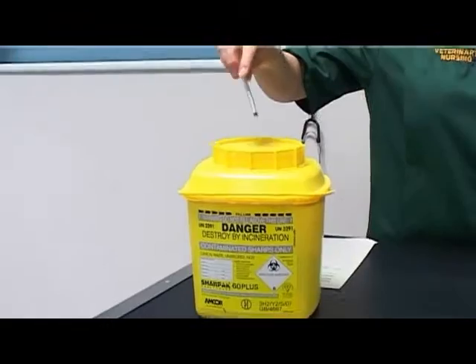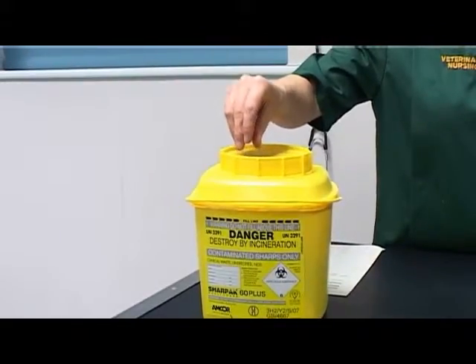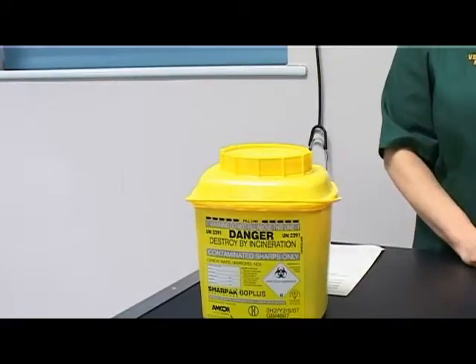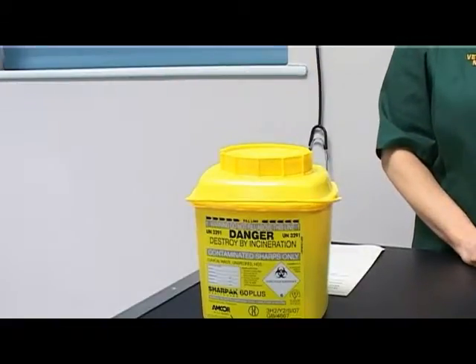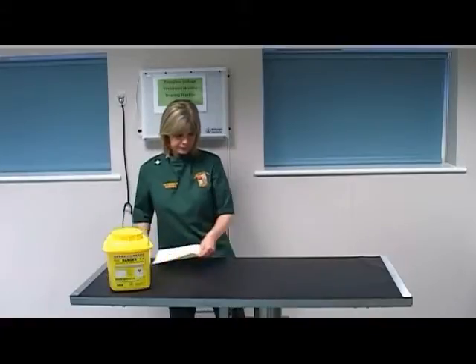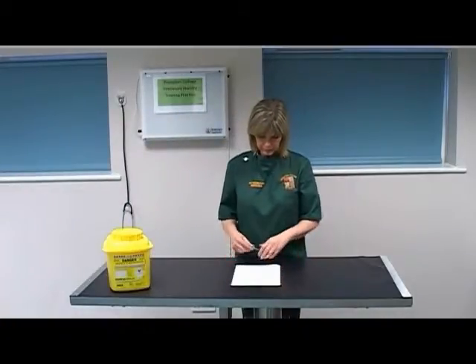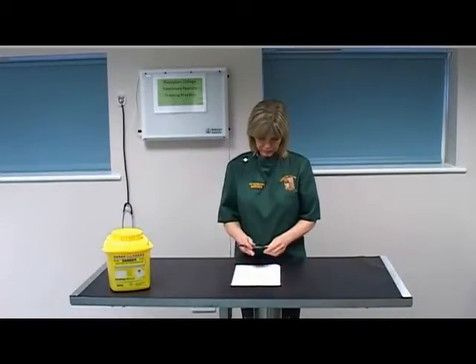Dispose of the used syringe and needle in a medicinal sharps bin without resheathing the needle. Record administration of medication fully on a hospital chart.